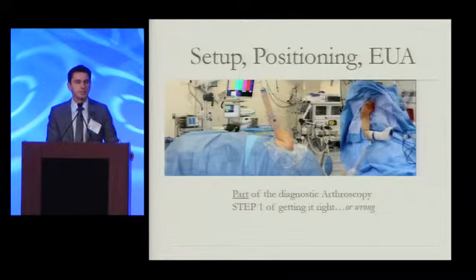So setup, positioning, and exam under anesthesia. These are those basic steps that Dr. Trenhill was remarking about. It's very important. It's part of your diagnostic arthroscopy. What do you see? What does the shoulder give you? Is it stiff? Is it loose?